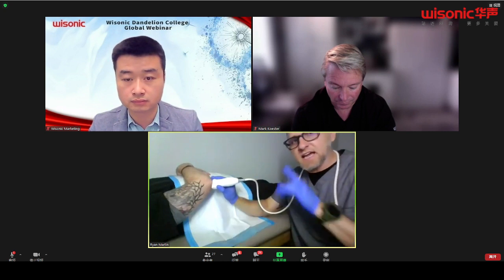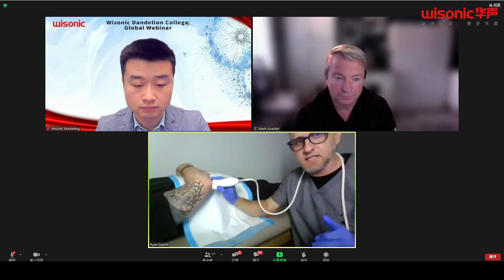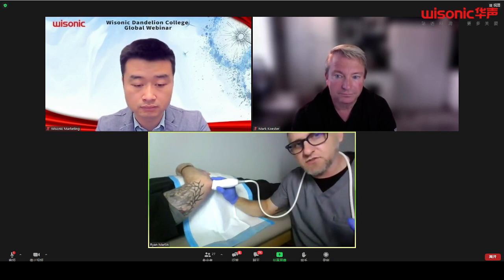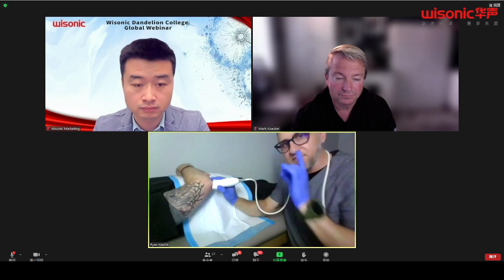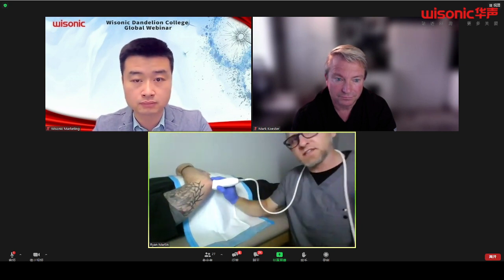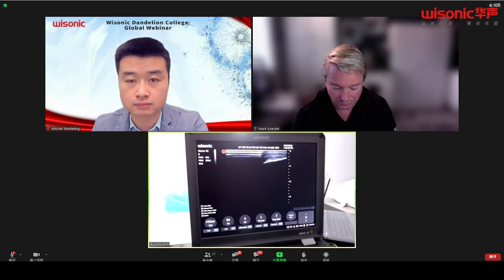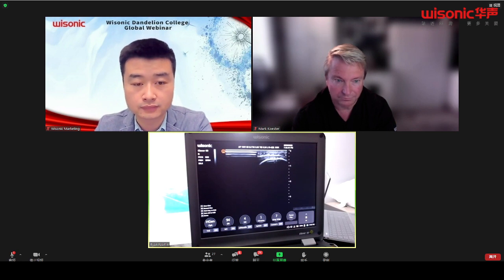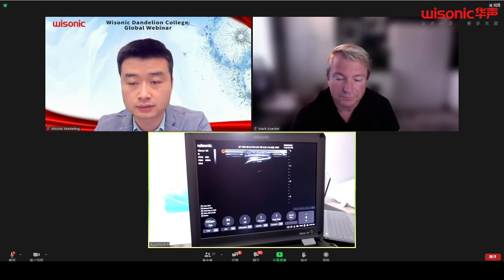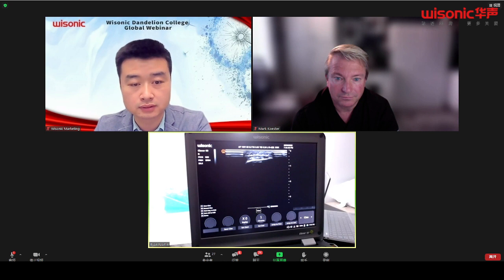But here's the thing: I don't care if I've already cleared that more proximal end and I don't know what's going on in that distal end. I don't care if I lose that visualization on my screen. As long as I can see that distal end and finally clear without a reasonable doubt that that's not a tear, then I don't care if the rest of the screen is black as long as I get that good picture. So let's take a look. So yes, I'm really highlighting on what they call the toe, but I can see that most distal end is intact. And that's what I care about, not making a false claim on a rupture or a tear.